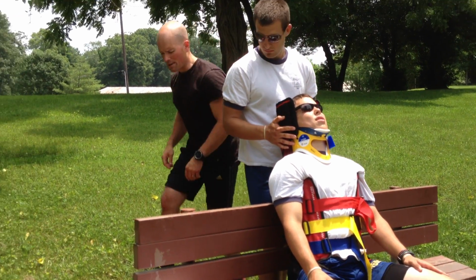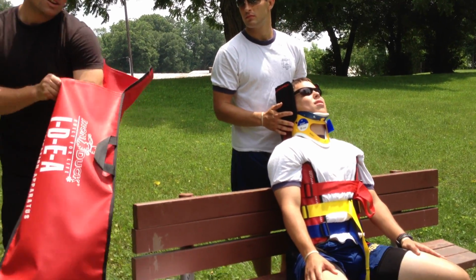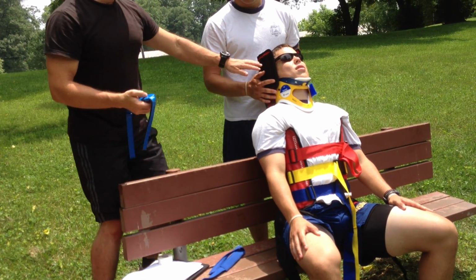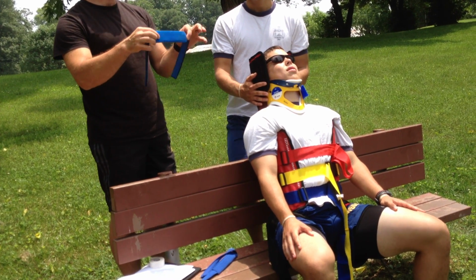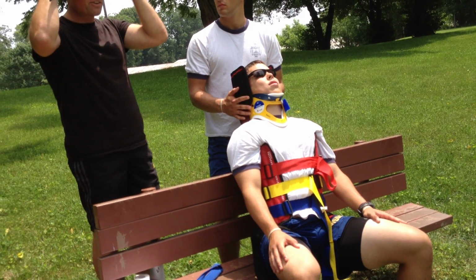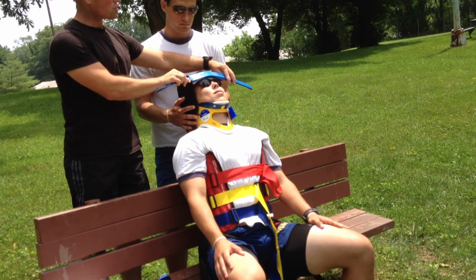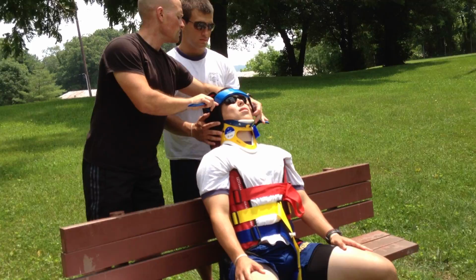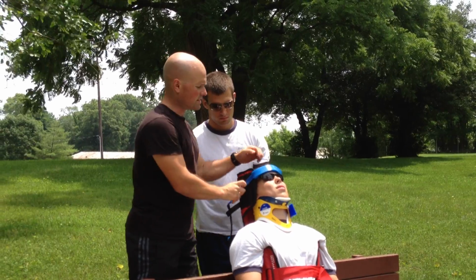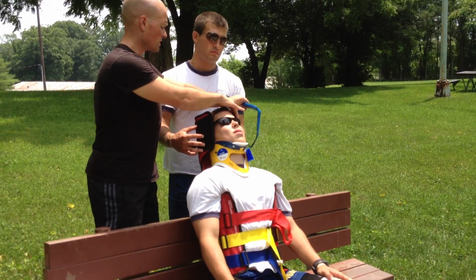We have these WIMP straps, and I don't mind telling you that the WIMP straps, they're out there, but some people really frown on the WIMP straps, just because with the Velcro that is here, and they've tried to make it blood and germ resistant, but that also makes it really slippery. It just slips right off your head. So I think it's probably not the best. The idea with that would be to put this strap on the patient's forehead and affix the Velcro, something like this. But as I said, I think that's probably too slippery. So I don't really like it.